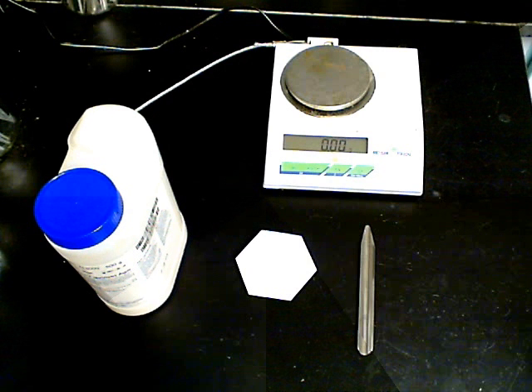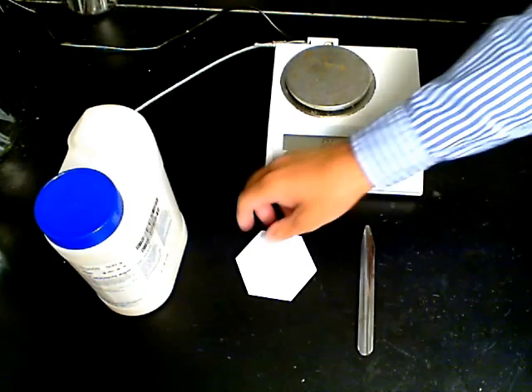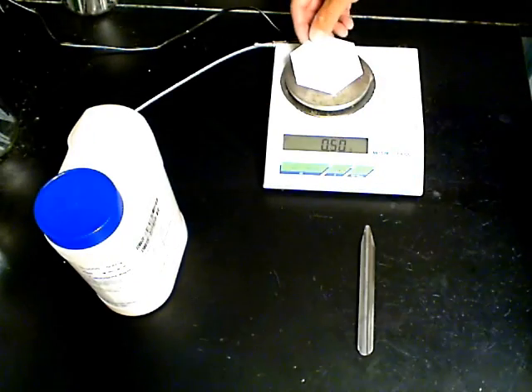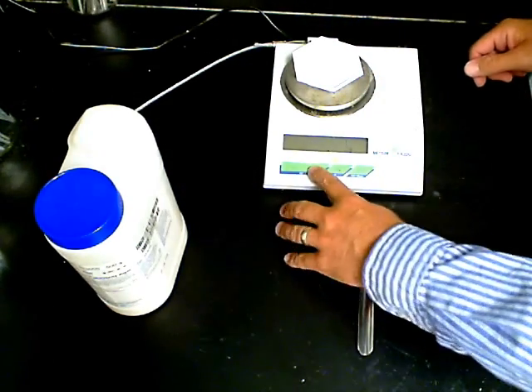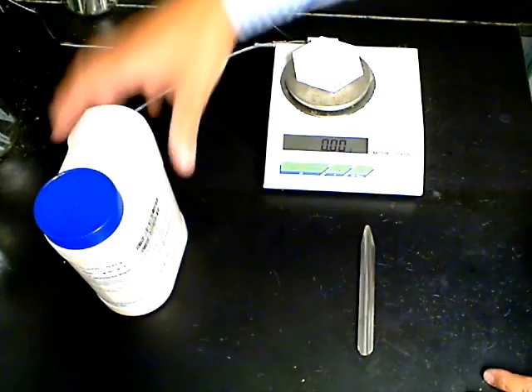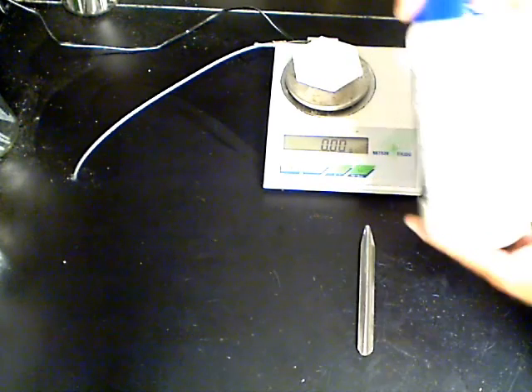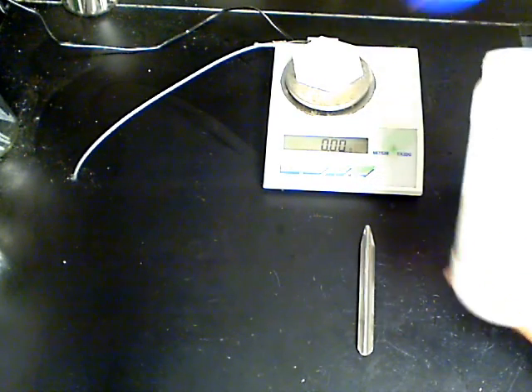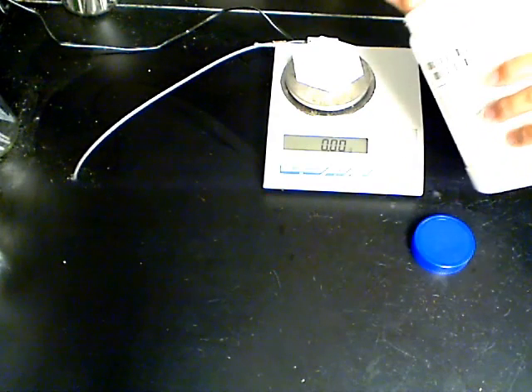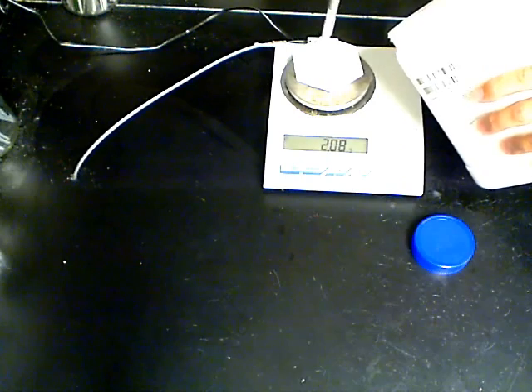To begin, place the weigh boat on the balance and then tare or zero the balance so that the value showing on the scale excludes the mass of the weigh boat. Using the spatula, scoop a small amount of powder onto the weigh boat. Continue doing this until the balance indicates the desired amount of material, in this case 11.5 grams.